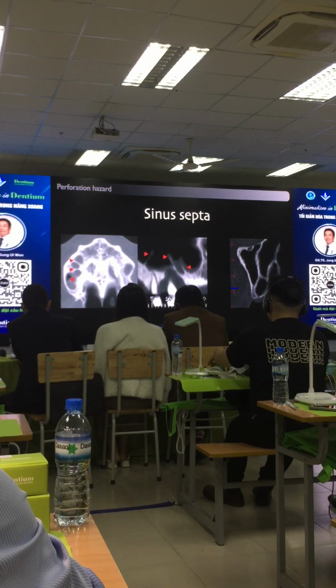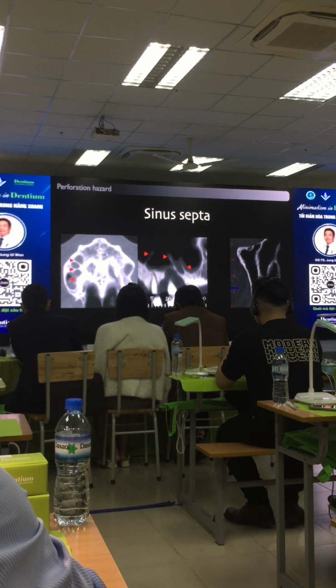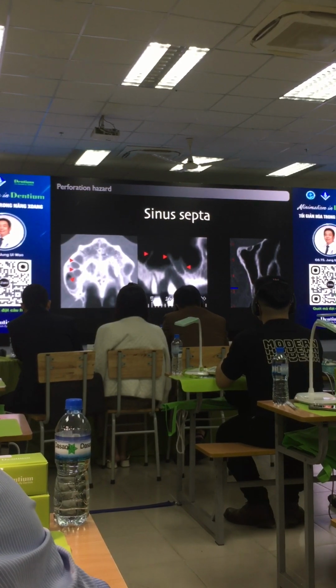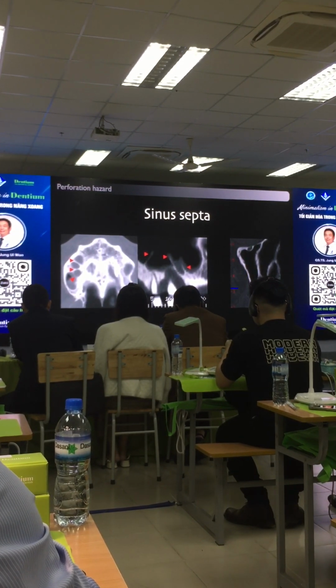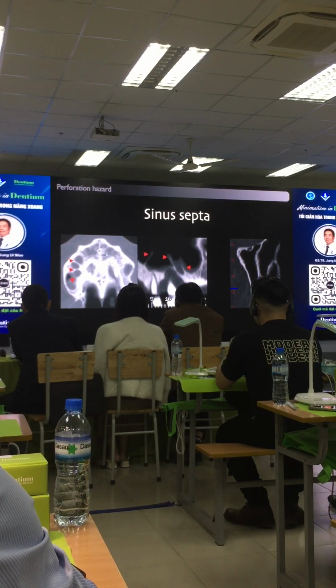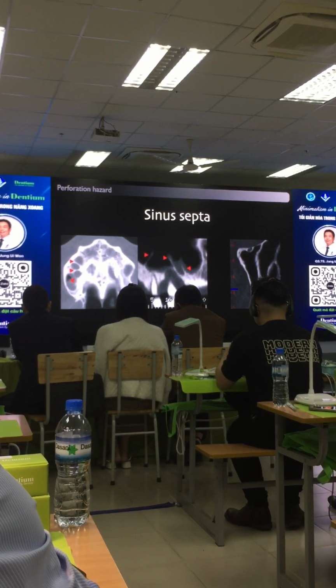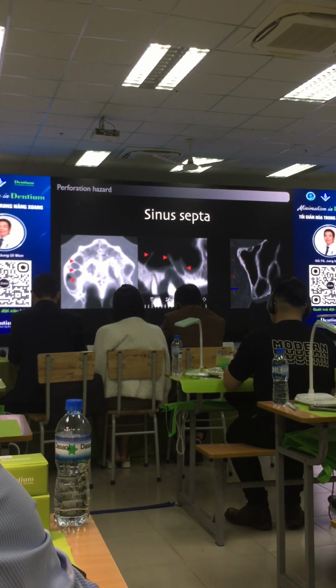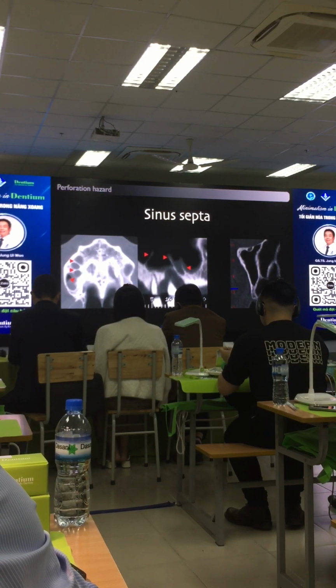The presence of sinus septa can make sinus membrane elevation difficult and increase risk of membrane perforation. Also, in the cases where presence and location of the sinus septa is unclear, hinge type of the window cannot be used. Therefore, it is crucial to figure out the location and the size of the sinus septa using CT analysis before surgery.